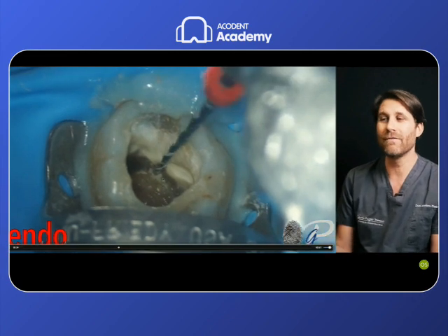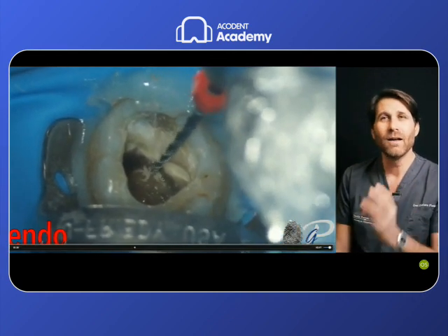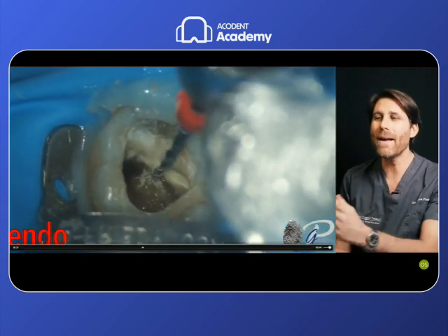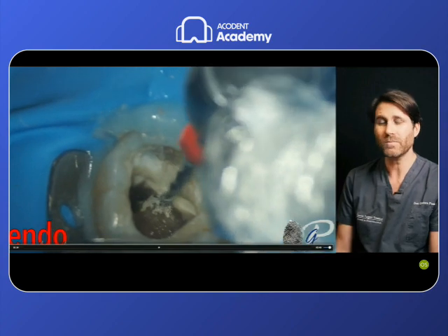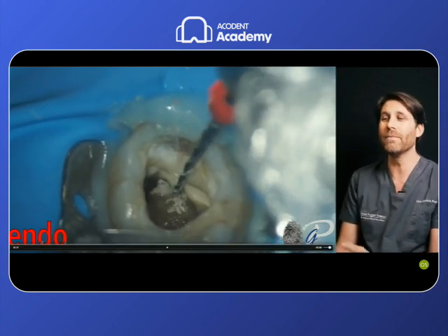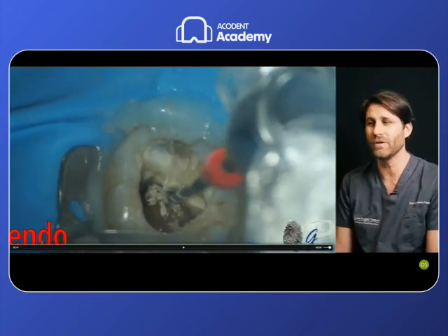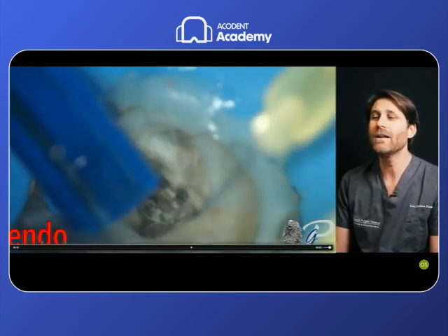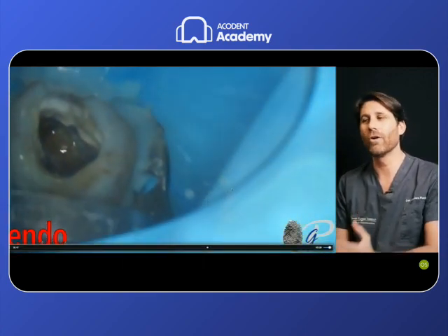The tip, 25 taper 8 for 3 millimeters, is flexible enough, but has enough metal mass to penetrate these coronal interferences in this coronal trajectory. The flexibility of the file permits it to follow this coronal curvature without modification of this curvature, other than the modification that we need to penetrate this root canal, so the relocation of the orifice.